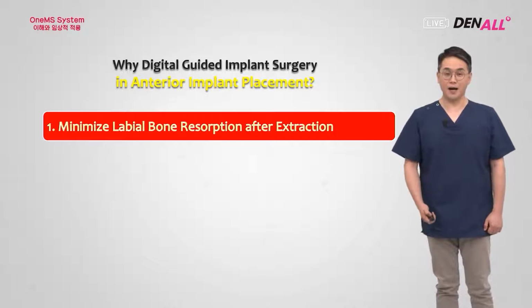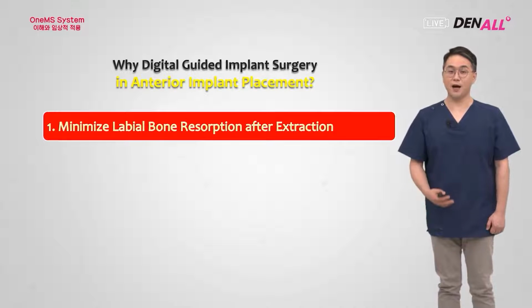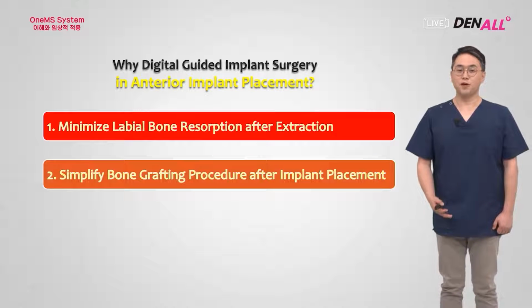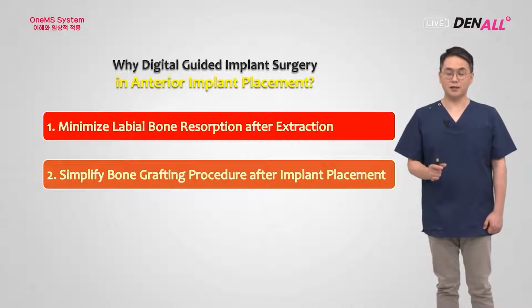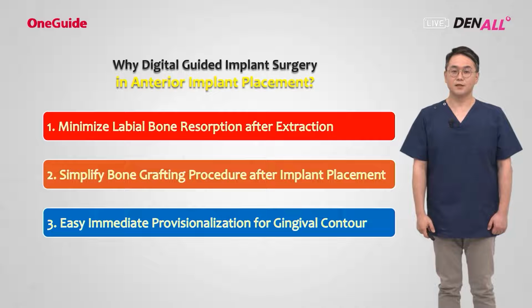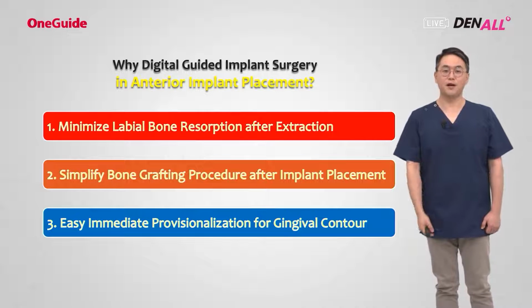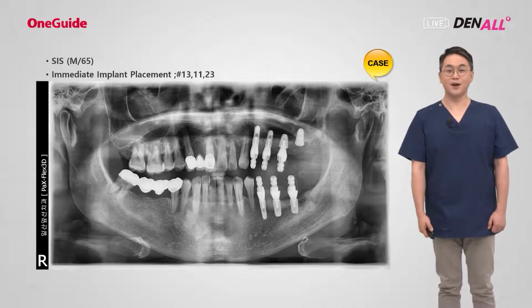But the recommendation, because of that, is also to go flapless surgery. But if you can do guided surgery, then you can minimize bone resorption. And secondly, you can simplify the bone grafting procedure. Because you can control the gap size, graft material can easily be put into that gap. And thirdly, provisionals will be created beforehand and delivered immediately, making it more aesthetic. Let's look at one such case.